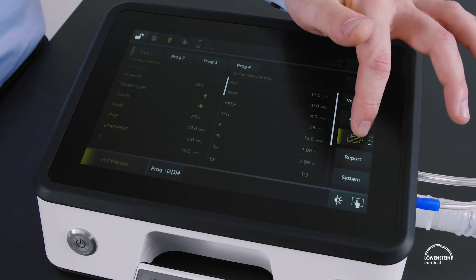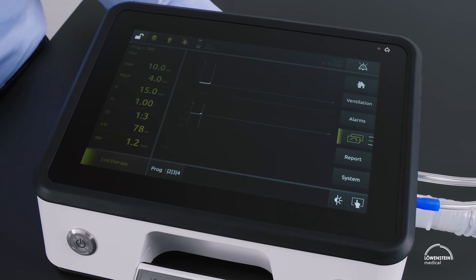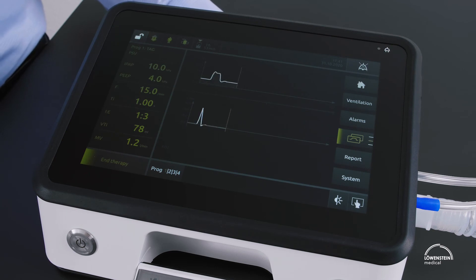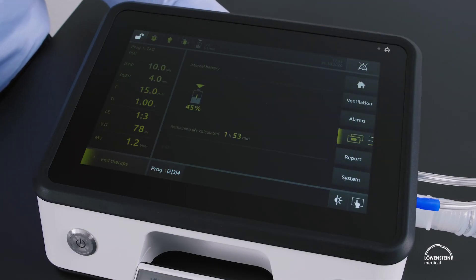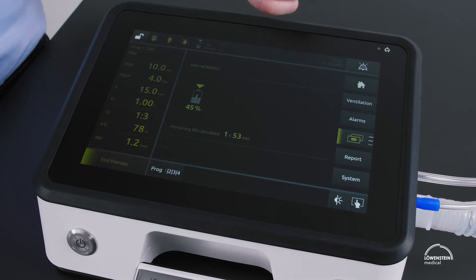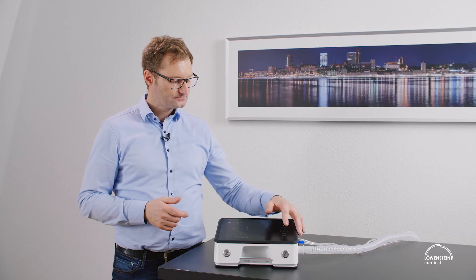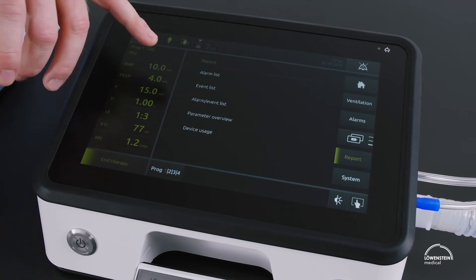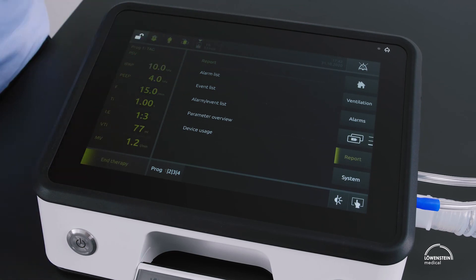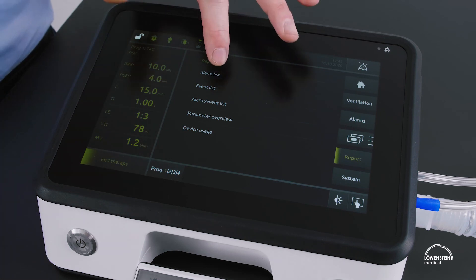We also have a curves view showing pressure, flow, and volume curves — you can select two out of three. There is also the battery or mobility view, where all batteries are displayed with remaining capacity and remaining time in hours and minutes. In the report menu you can access lists such as the alarm list, event list, or parameter overview.